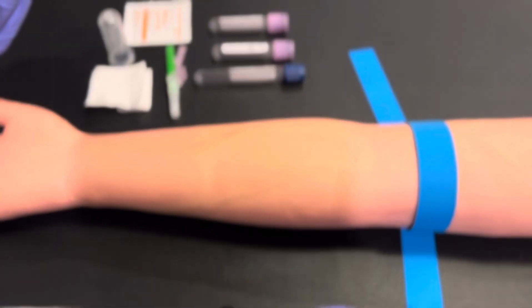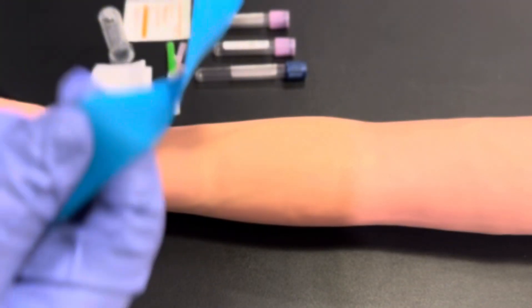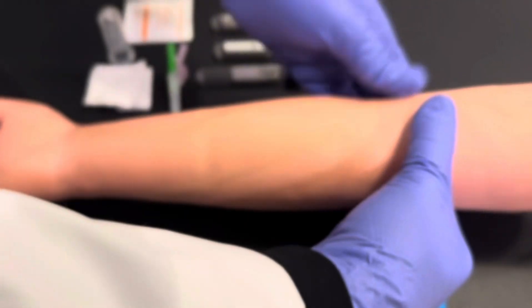Welcome back to another segment of Mastering Phlebotomy. Today we're going to focus on the multiple sample straight needle venipuncture.